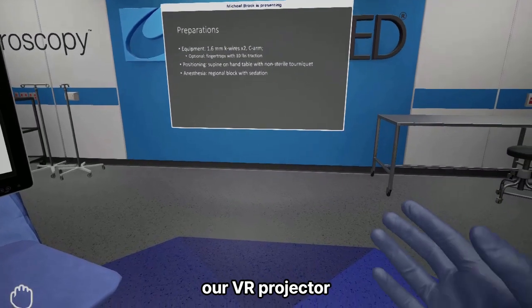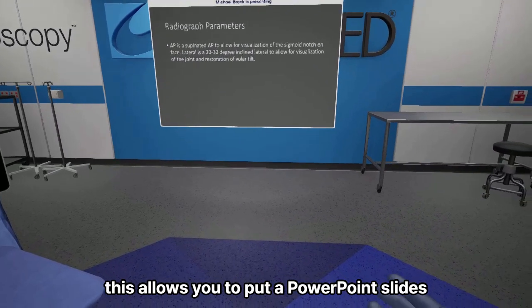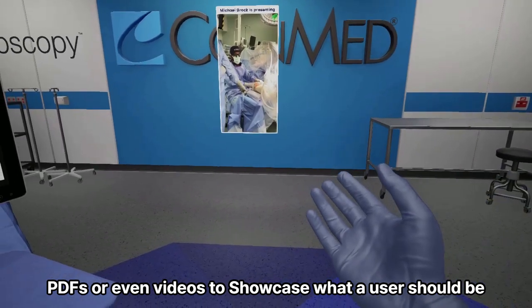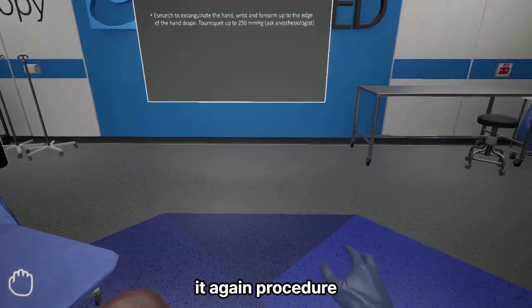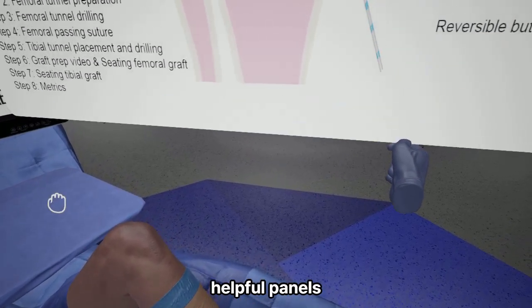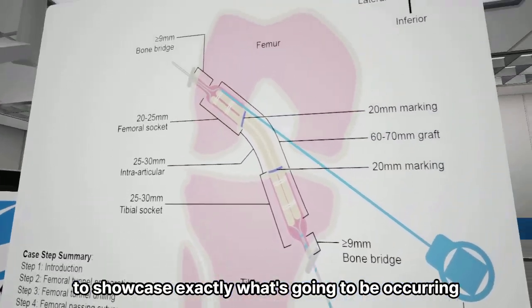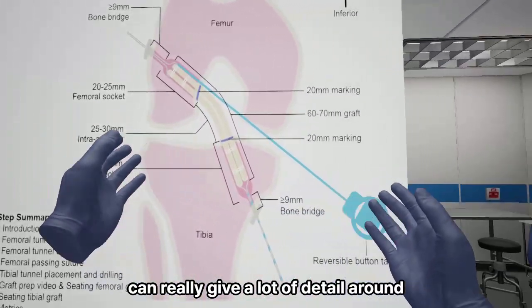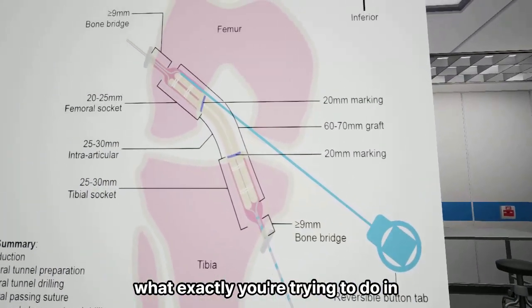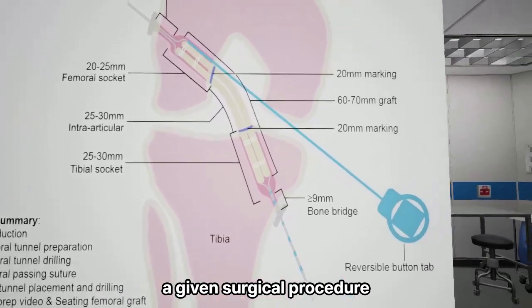Our VR projector allows you to put up PowerPoint slides, PDFs, or even videos to showcase what a user should be doing in a given procedure. Helpful panels to showcase exactly what's going to be occurring within a surgery. These helpful panels and guides can really give a lot of detail around what exactly you're trying to do in a given surgical procedure.